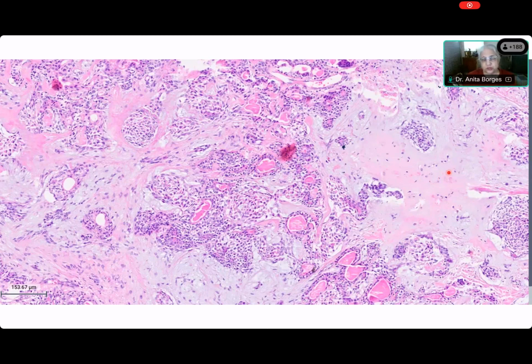Now somebody has mentioned mixochondroid. Very good. That is a feature of myoepithelial cells. There is abluminal differentiation. Very good. It's a feature of myoepithelial cells. Basaloid, as we saw in the previous thing. Variegated appearance. Anything else? And if you don't notice it, that is really a sad thing. So what is it? Come on, abluminal cells are diffusing into the stroma.